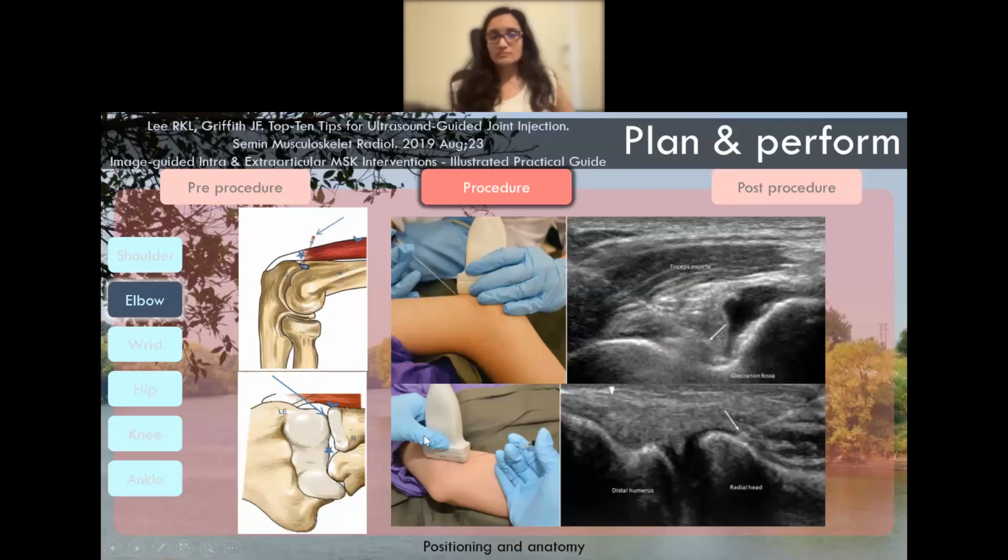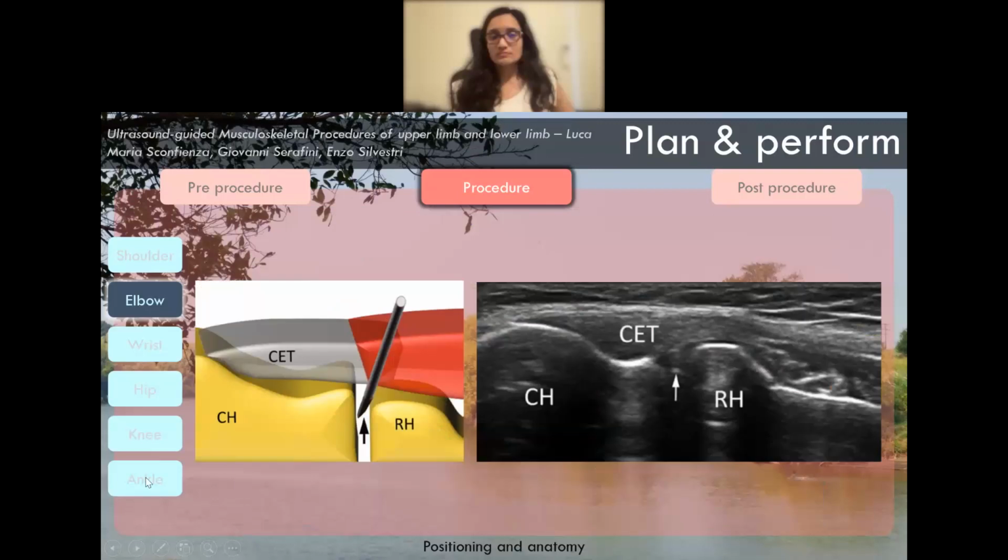And regarding the lateral approach, once again we can keep the arm by the side of the patient. Here we can ask the patient to sit, and over the table in a semi-pronated way we can keep the arm. And here we can see the common extensor tendon, and this is the lateral collateral ligament. We are just coursing through that and reaching the bare area of the elbow joint in the lateral recess approach.